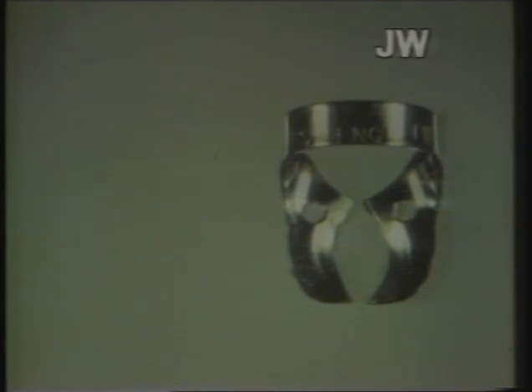In situations where the clamped tooth is also the one on which the operation is to be performed, and additional access is required to its distal aspect, there is an extended bow version of the AW, which is the HW. When a molar tooth has good available natural undercuts, a BW clamp can be used. It has a linear tooth contact with a flat jaw angulation. If the molar is large, the JW may be more appropriate, whereas if it is small and the BW is unstable, then a DW should be used.